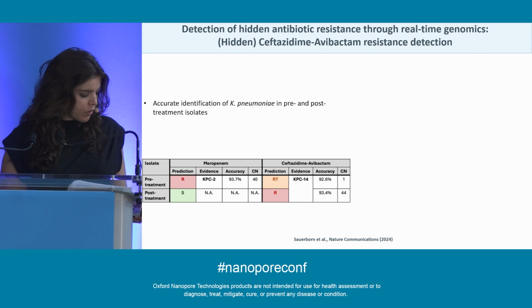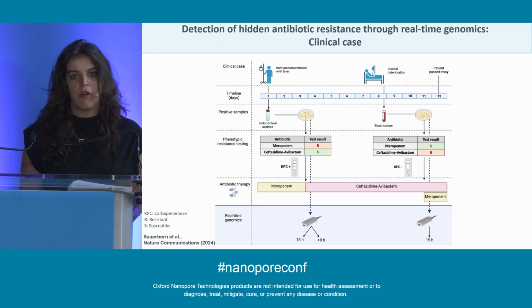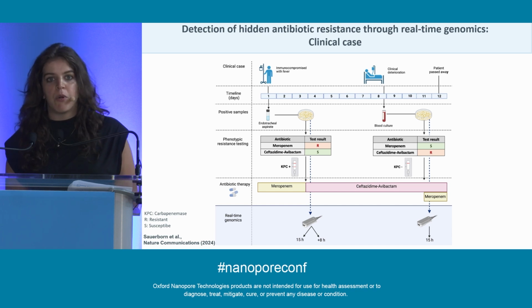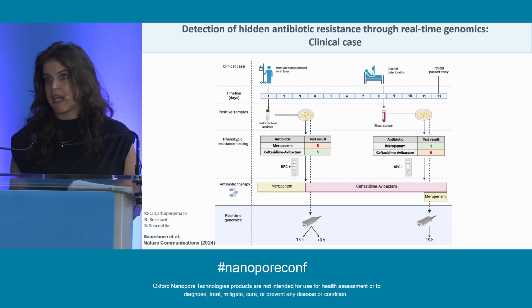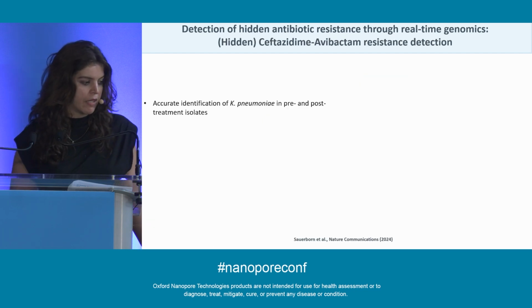Now, crucially, for the post-treatment isolate, while it was resistant to ceftazidime-avibactam, the clinically established approach did not detect any resistance conferring mechanism shown here, with the lateral flow test coming back negative. So we had no information on the resistance conferring mechanism here.